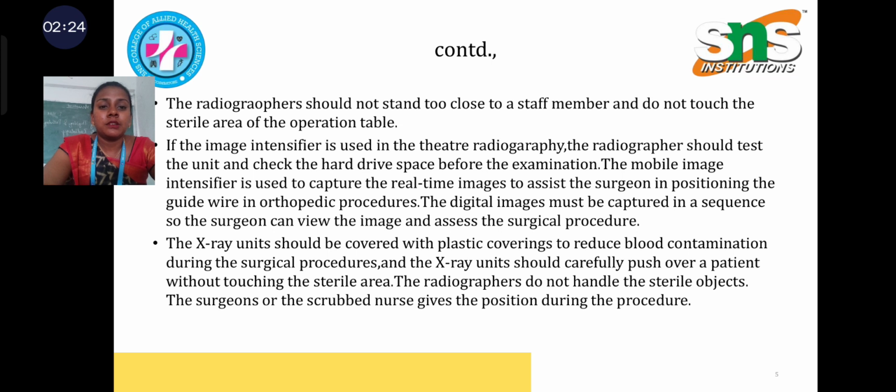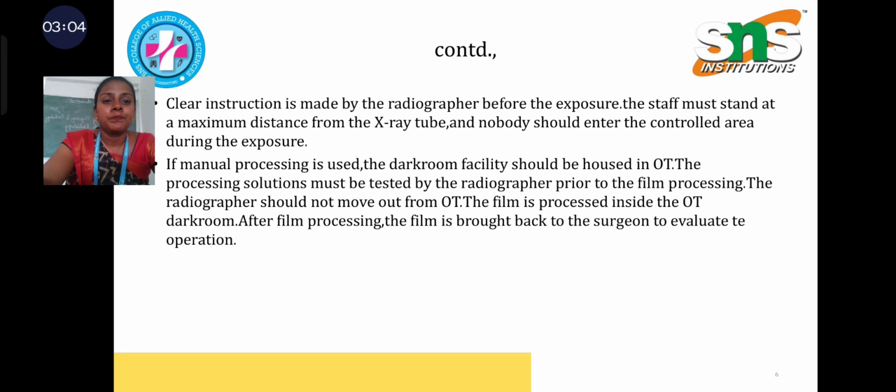The mobile image intensifier is used to capture real-time images to assist the surgeon in positioning the guide wire in orthopedic procedures. The digital images must be captured in a sequence so the surgeon can view the image and assess the surgical procedure. The X-ray units should be covered with plastic coverings to reduce blood contamination during the surgical procedures, and the X-ray unit should be carefully pushed over the patient without touching the sterile area. The radiographers do not handle the sterile objects. The surgeons or the scrubbed nurse gives the position during the procedure.